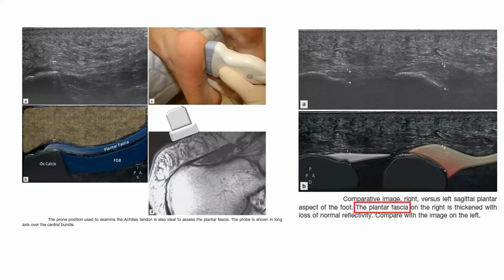Those are also available in the market. It depends upon the clinical setting. But there is no excuse of not using any of these. You have to use aseptic precautions depending upon your clinical availability, like Tegaderm plastic, or even condoms can be used. Or if the patient is willing to pay, then preformed covers are also available. But you have to use any of these three. You cannot do the procedure without any aseptic precautions.